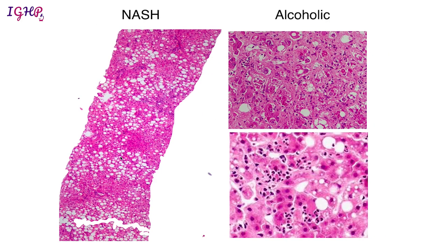This case of non-alcoholic steatohepatitis shows macrovesicular steatosis of moderate degree with some lobular inflammation. In alcoholic hepatitis, you can see numerous Mallory bodies accompanied by a fair number of polymorphs. In the lower panel, neutrophilic satellitosis is visible — clusters of polymorphs seen in the vicinity of hepatocytes. This occurs because lipopolysaccharides absorbed through the gut in alcoholic patients are expressed on the surface of hepatocytes and act as chemotactic signals for polymorphs.